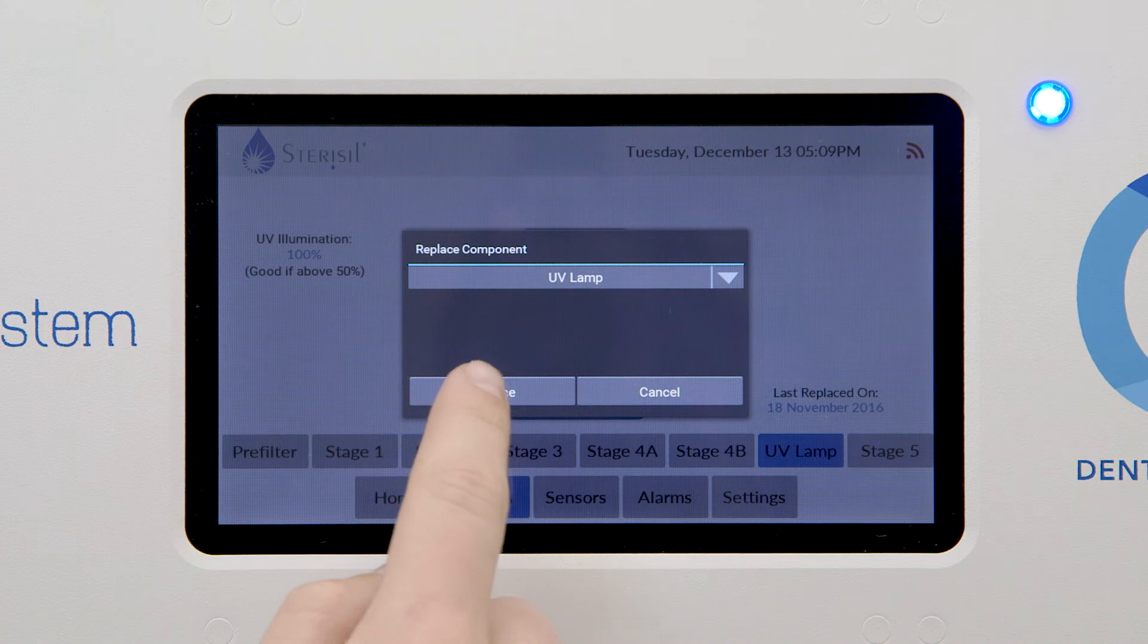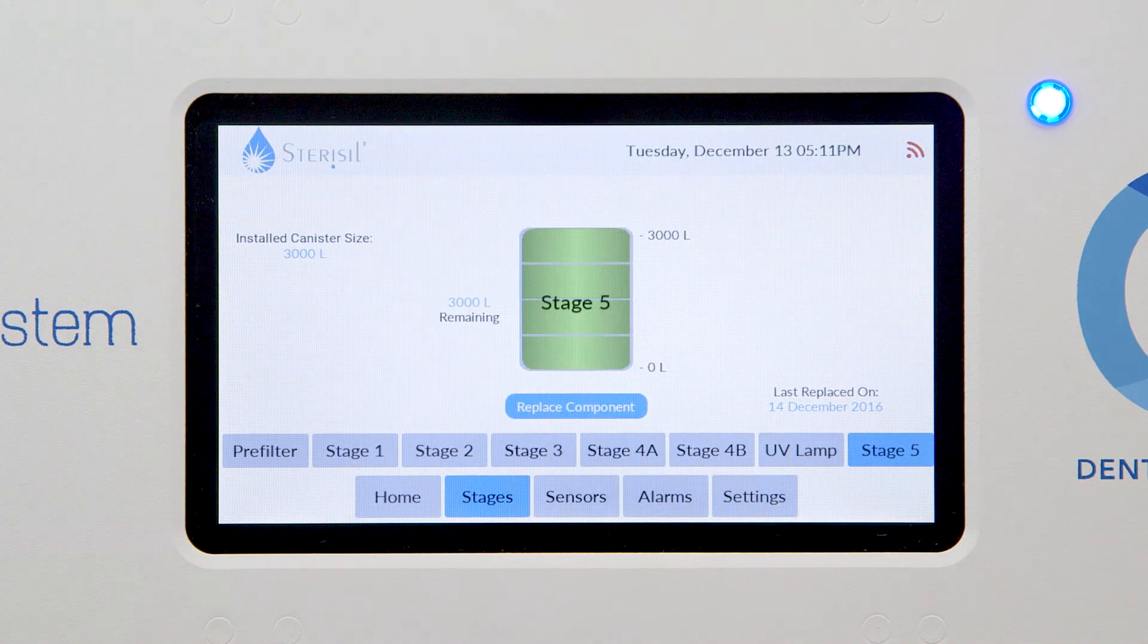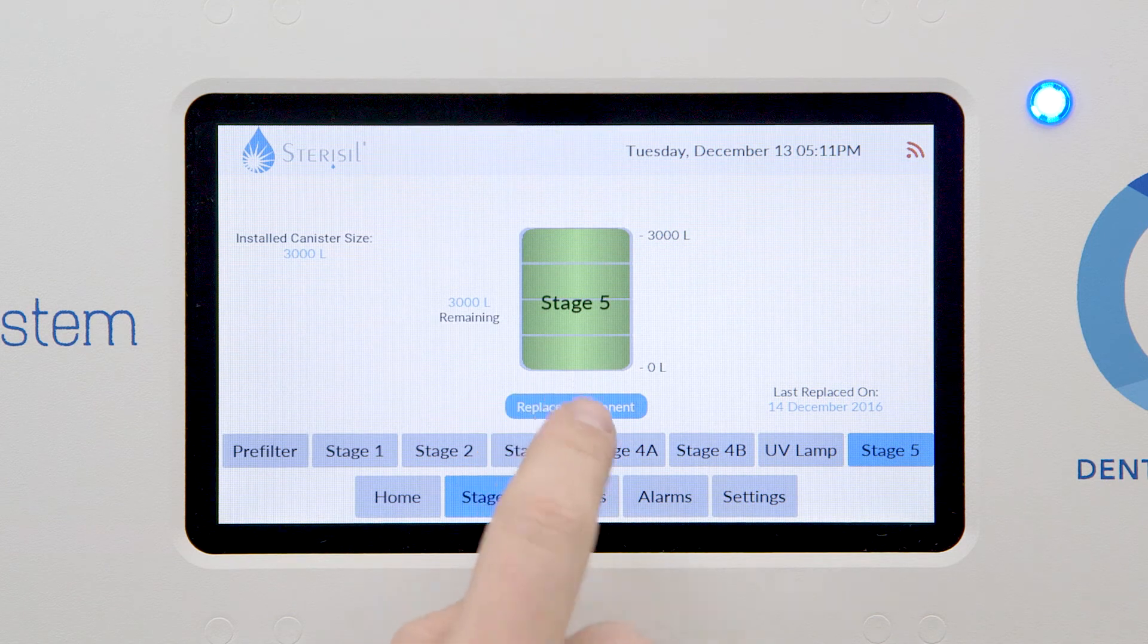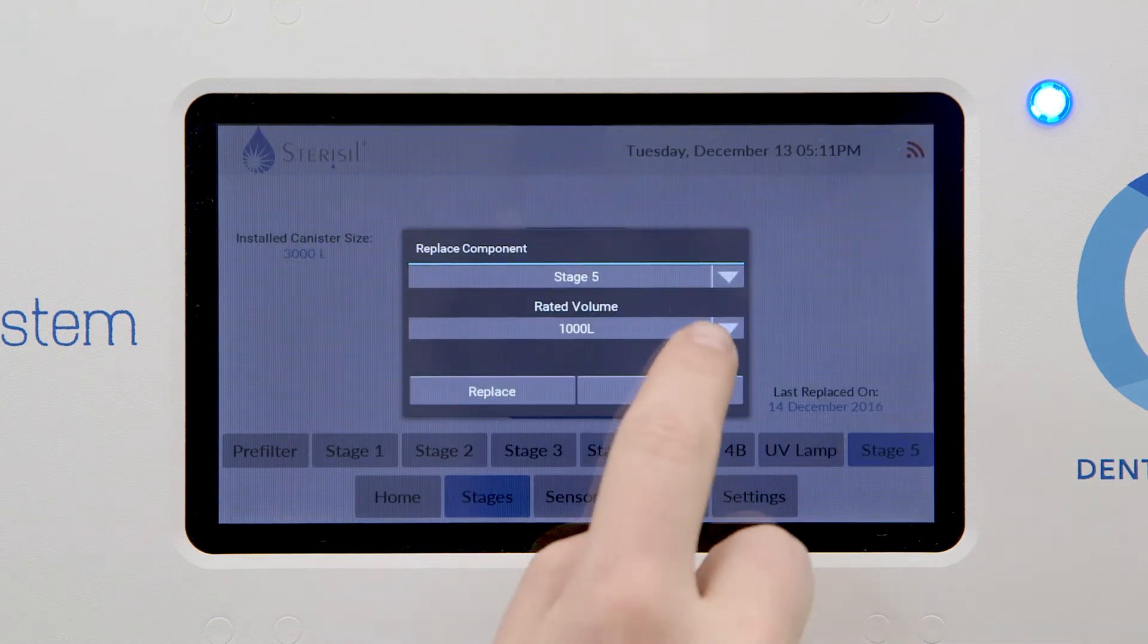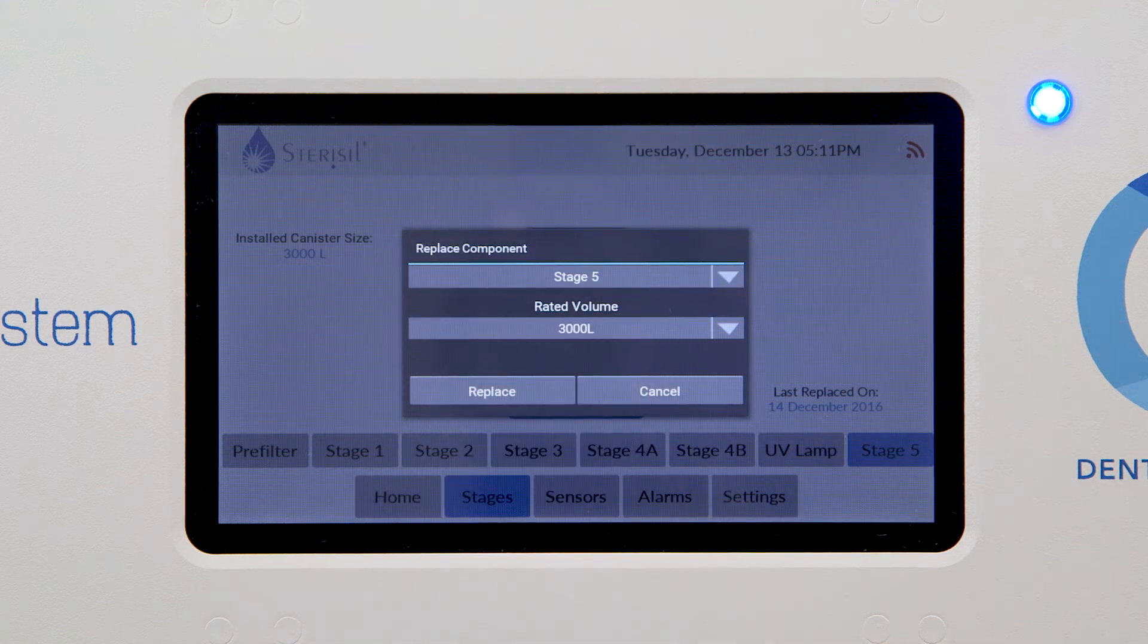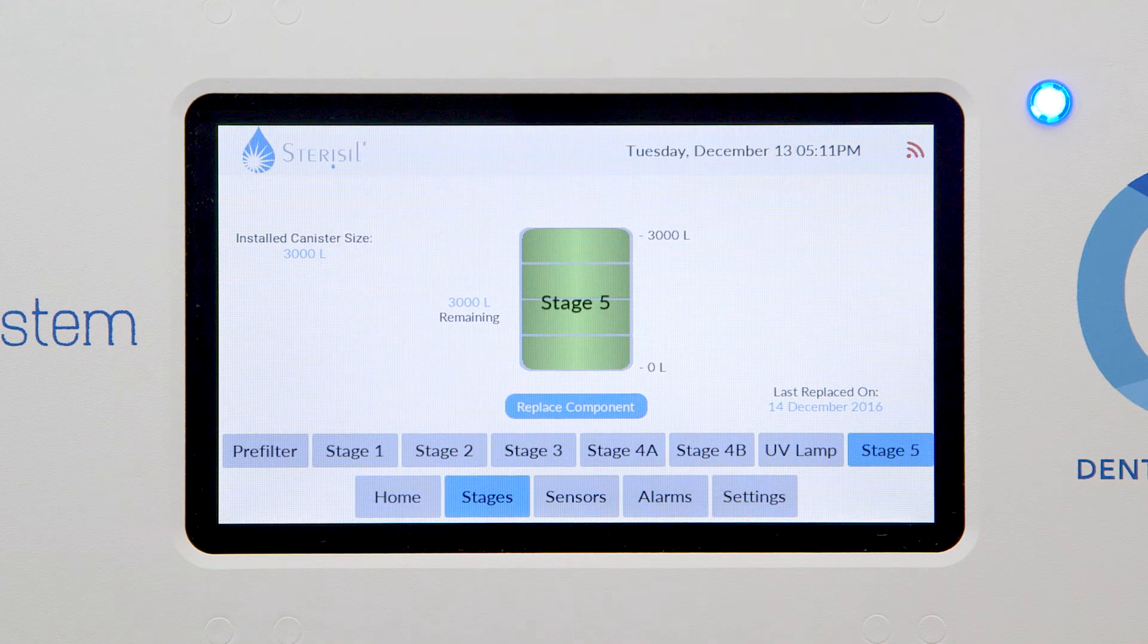Stage 5's lifespan is based on a liter count. Each Stage 5 is marked with its liter capacity. From the Stage 5 Details screen, verify that your maximum capacity matches the capacity printed on the cartridge. If not, reset the count to the correct number.